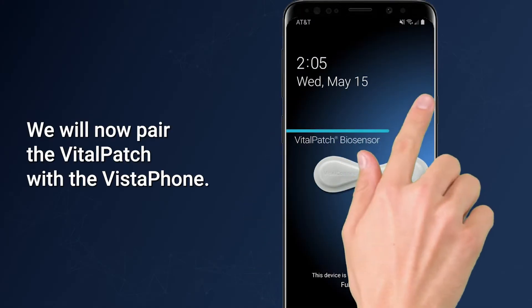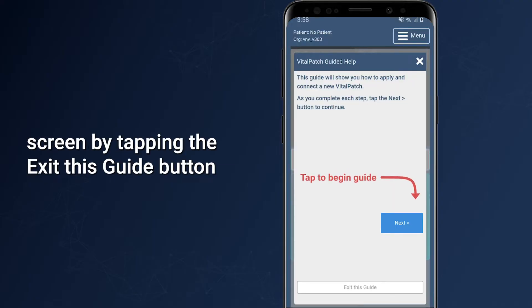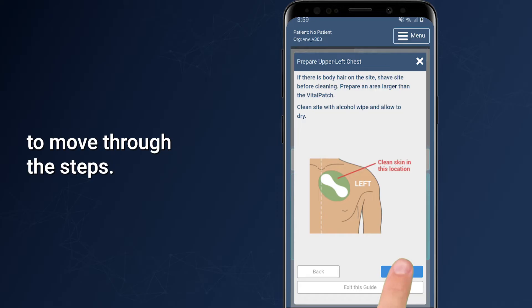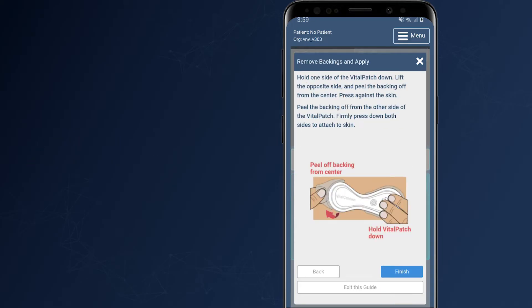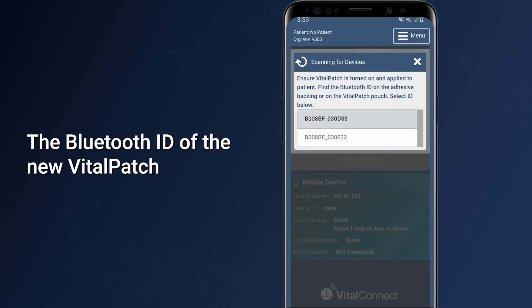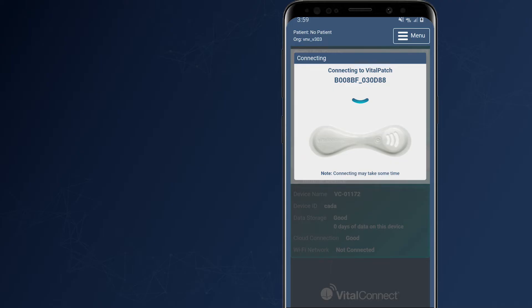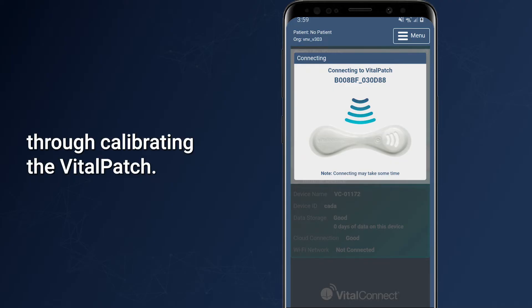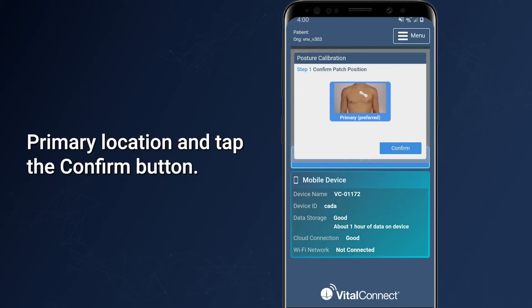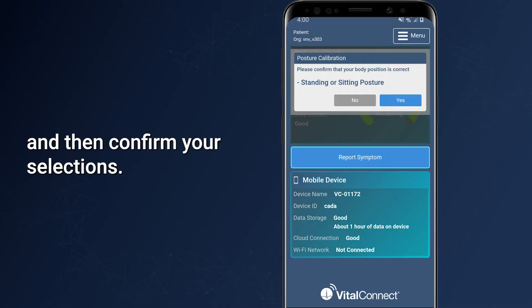We will now pair the Vital Patch with the Vistaphone. Unlock the Vistaphone and close the guided help that appears on the screen by tapping Exit This Guide, or tap Next to move through the steps. The Vistaphone will scan for patches, and the Bluetooth ID of the new Vital Patch should appear on the list. If the ID on the screen matches your Vital Patch, tap the ID to pair. The next screens will guide you through calibrating the Vital Patch — tap Calibrate to begin, confirm the patch is in the correct primary location, select your body position, then tap Calibrate and confirm your selections.